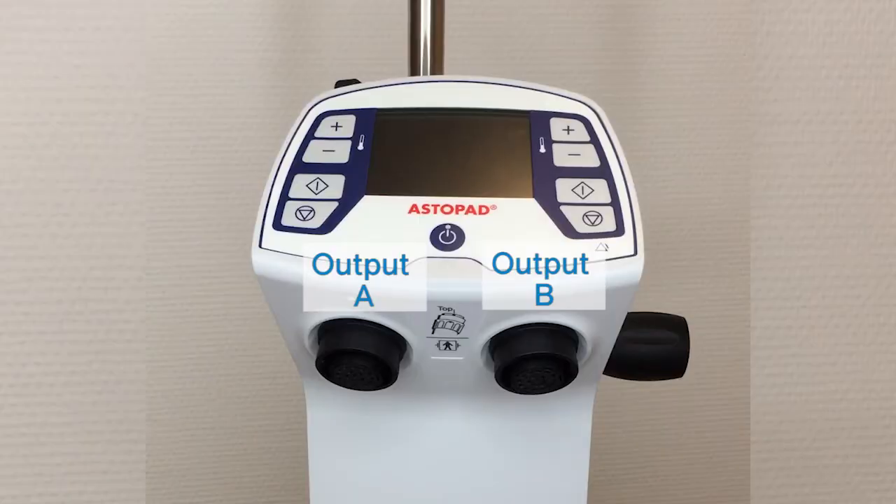The Astopad control unit has two outputs — device sockets A and B — for connecting the Astopad blankets. The Astopad is available with a battery option. When the battery is fully charged, the control unit can be operated for up to two hours without connecting to an external power source, facilitating warming during transport through the hospital as needed.